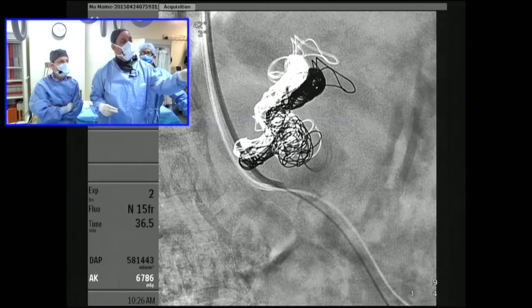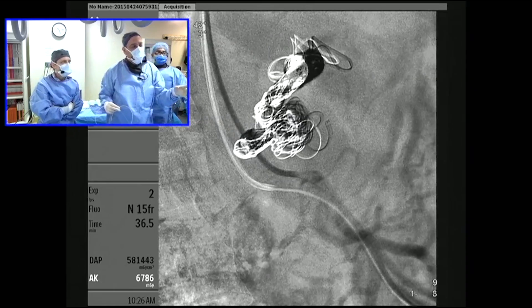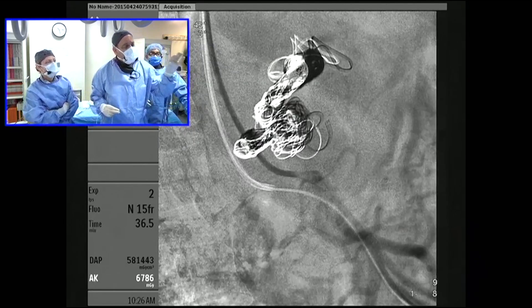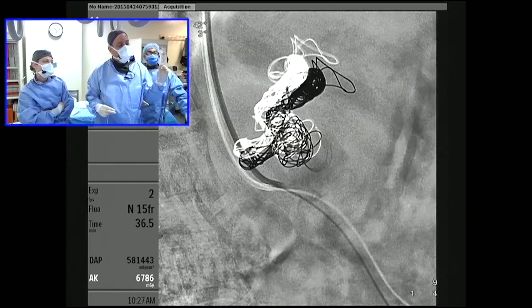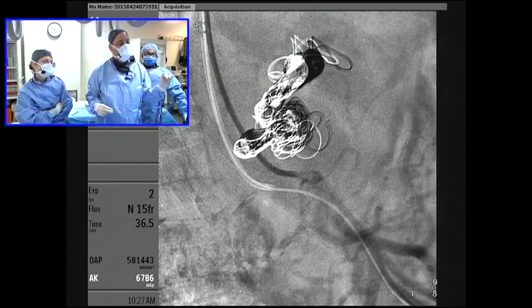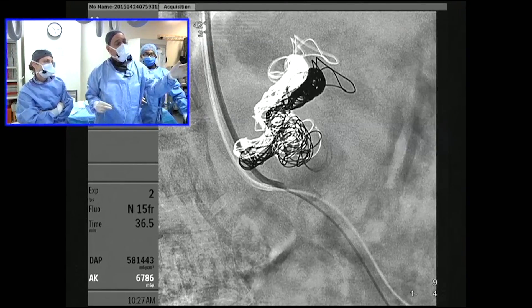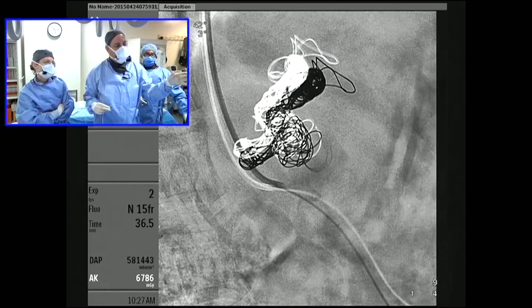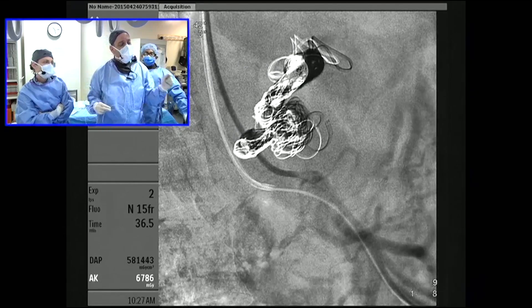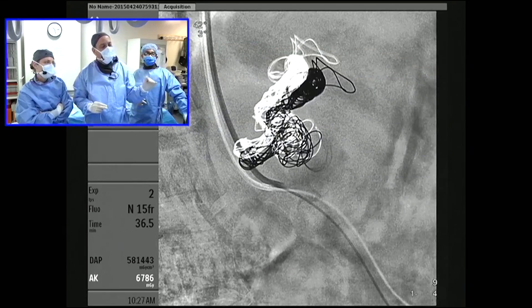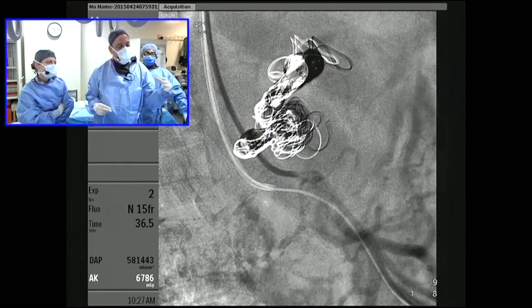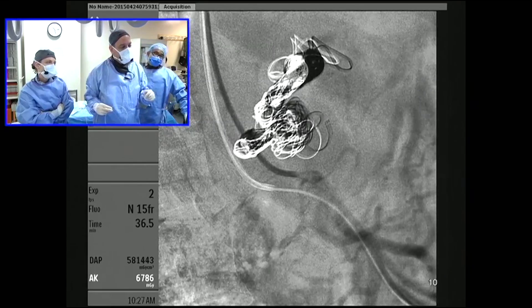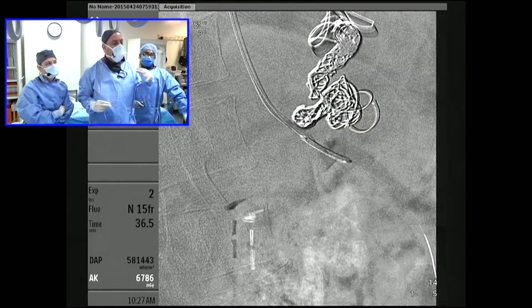Here you can see we've been pushed out. The aneurysm is still open, and we have our guiding system in the origin of the celiacomesenteric trunk. We then have a 035 wire down the SMA and are getting ready to deploy a covered stent across the neck of the celiac aneurysm.